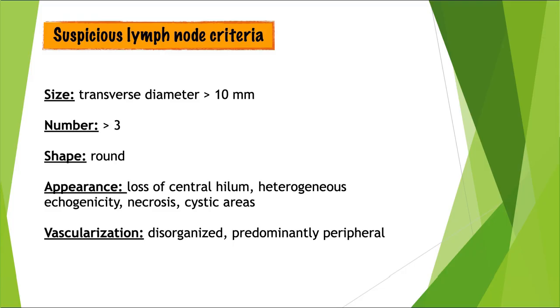As always, with ultrasound, you have to keep things simple so you don't get lost, and you need to have a clear understanding. So, quite simply, like with any ultrasound image, we're going to analyze the size, the number, the shape of our lymphadenopathy, and its appearance. Overall, its echogenicity, and of course, its vascularization, since every ultrasound image should get a quick look with Doppler.